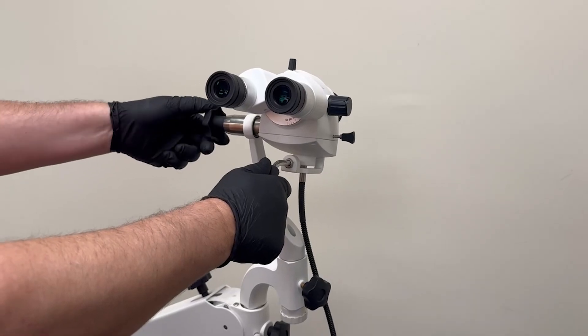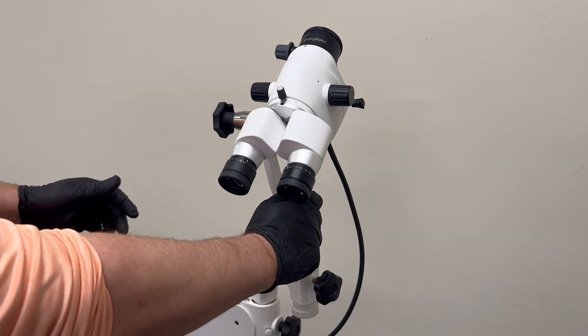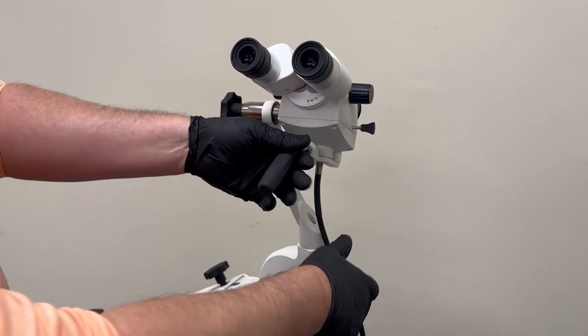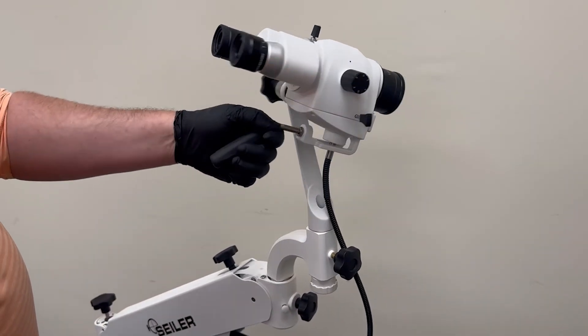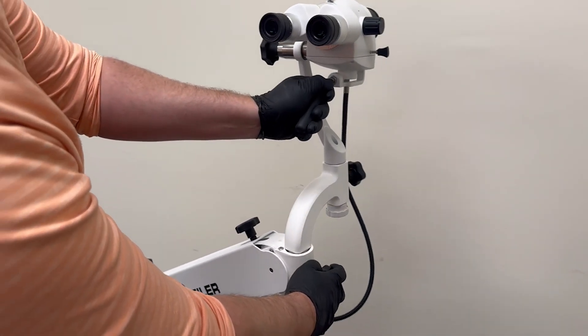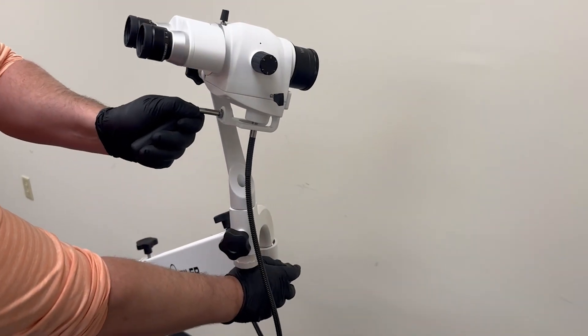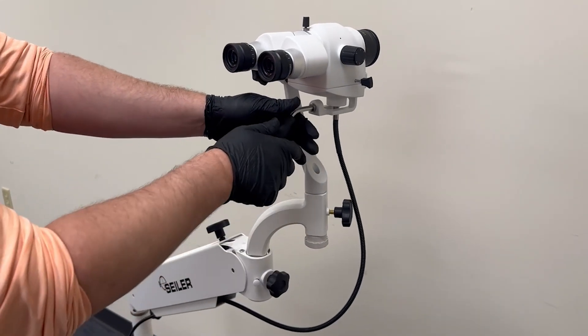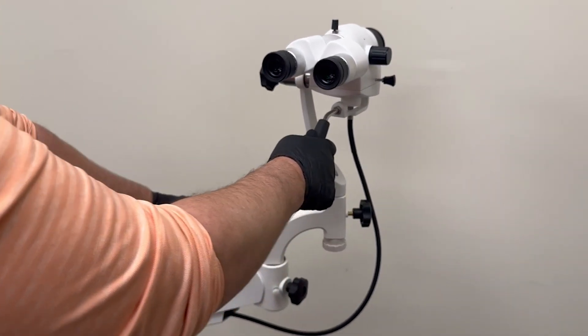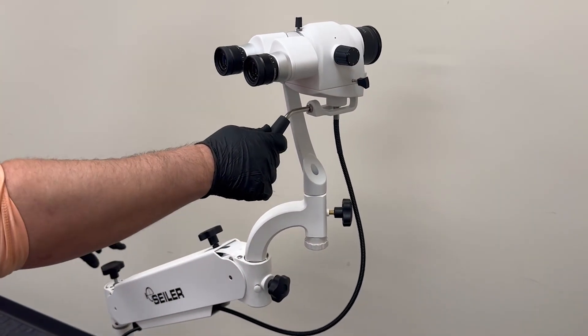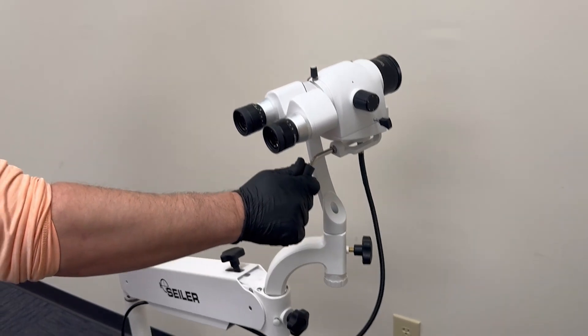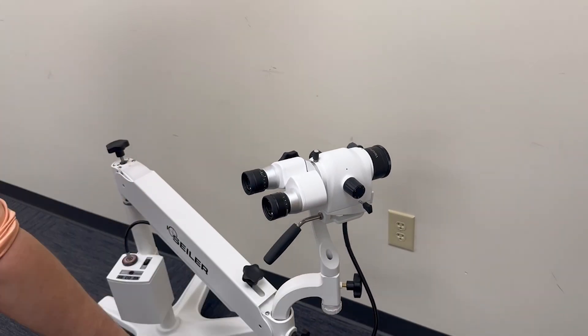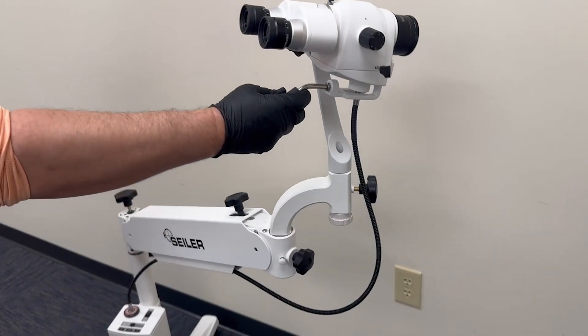The 955 Siler Colposcope is renowned for offering the best movement and articulation available in the medical industry today. Its design places each control knob strategically on the Colposcope body, allowing doctors to adjust and maneuver the device smoothly to their exact preferences. Siler uses a gas piston within its pantographic arm, which enables effortless vertical adjustments by a single finger.